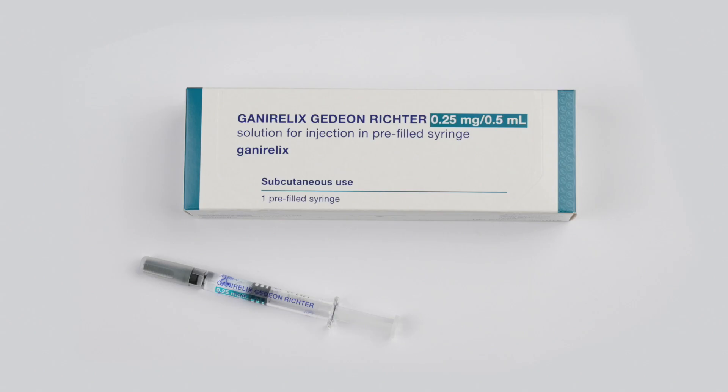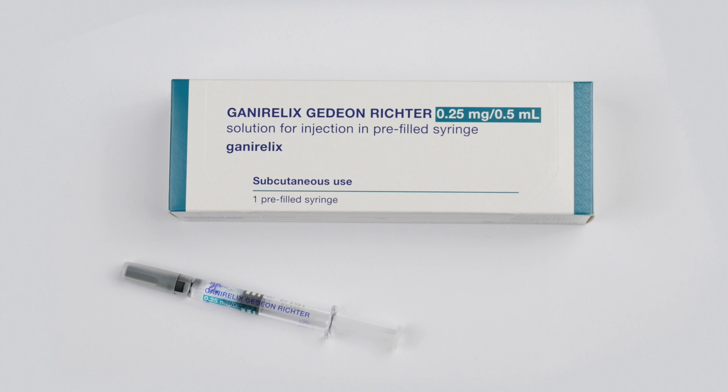Is any household disinfectant okay to use to clean the surface? Yes, any household disinfectant will be fine. Ganarelix Gideon Richter comes in a pre-filled syringe so you don't have to do any mixing or drawing up.